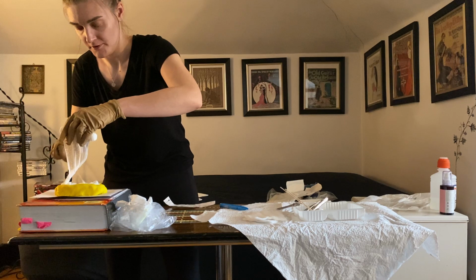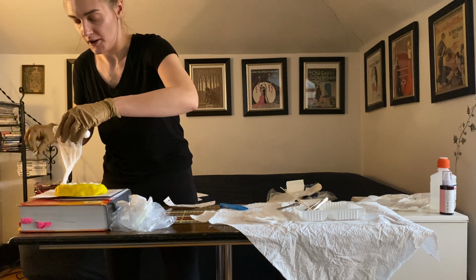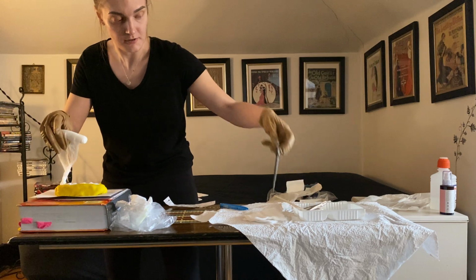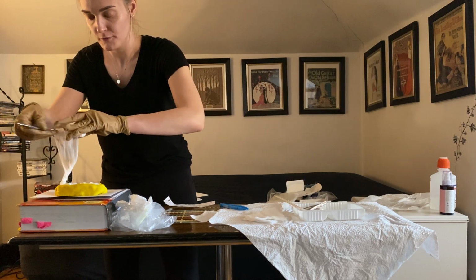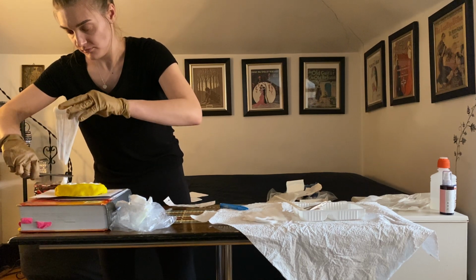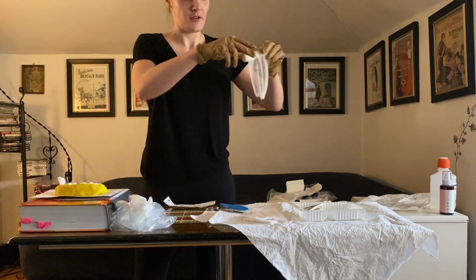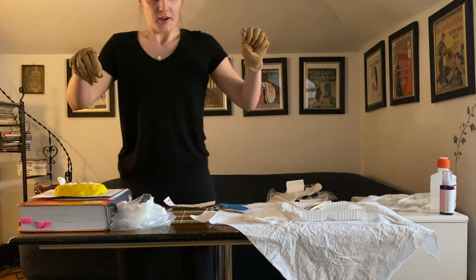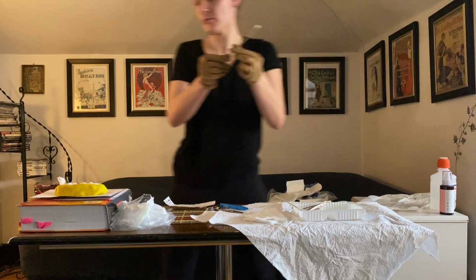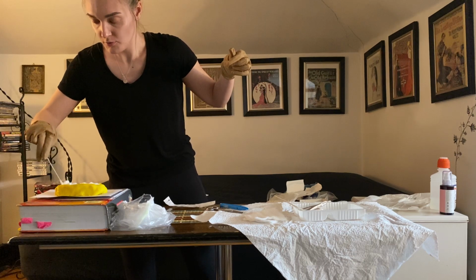Okay, so now that that is all packed, I'm going to show you the packing at the very end just because my camera's propped up, but I can dispose of that. And I'm going to go and grab my sterile scissors. Okay, so just putting that there and then disposing of that as well. So I've acknowledged the fact that my hands are no longer sterile. I just want to get that in more.